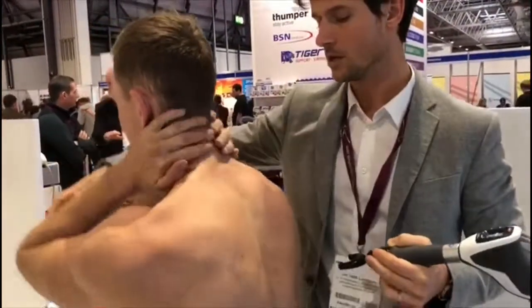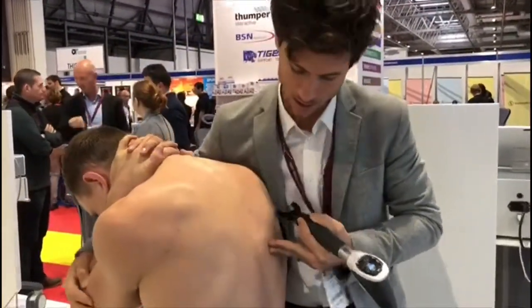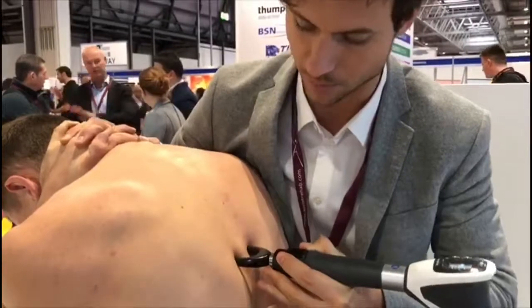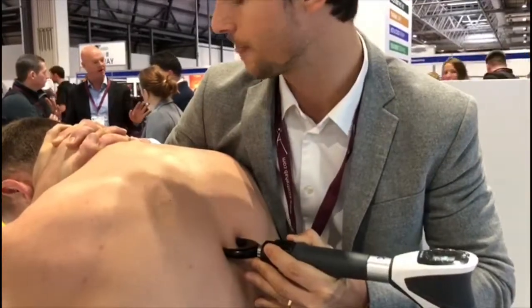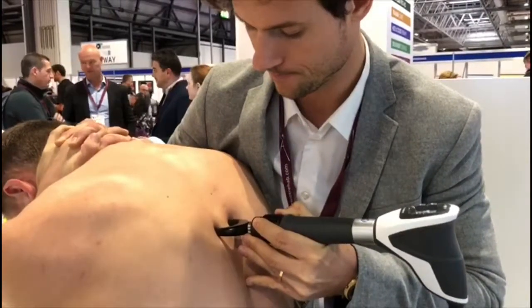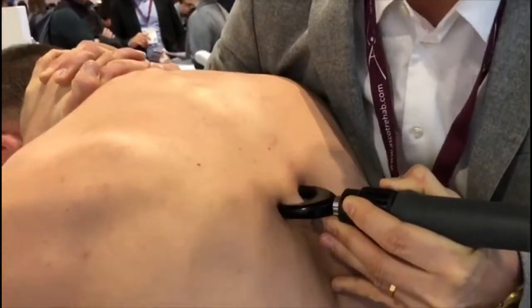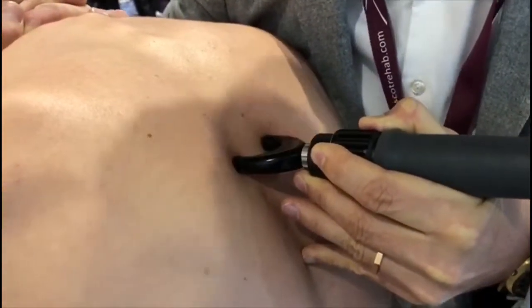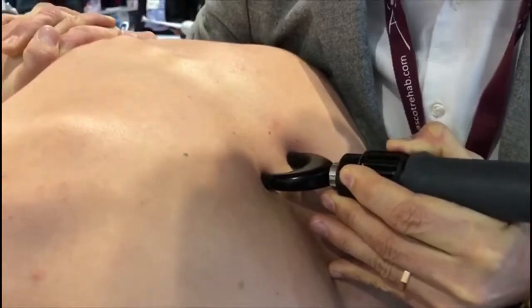You have the same position with your arms, but we'll flex your body like this. And then we'll try to do the same thing here. It will be a slightly different angle. We had a reaction from the muscles — a little twitch. Still comfortable? Yeah. This will be the joints as well, I think. You see there's a twitch in the muscles, but it calms down after a while. So that's okay. I think this would be the joints. Still the same twitch. Now it starts to calm down.